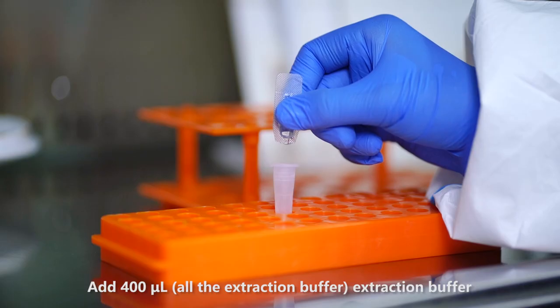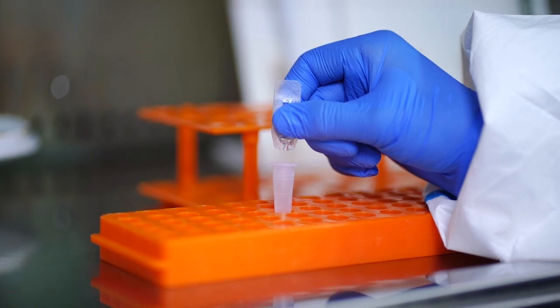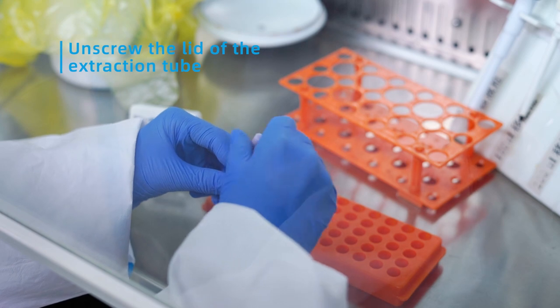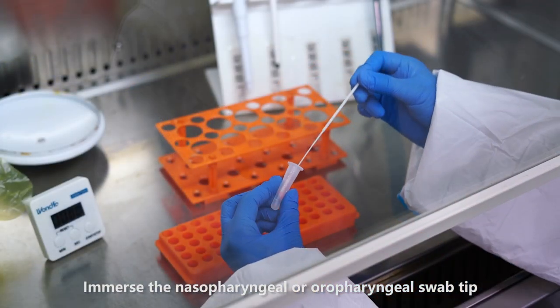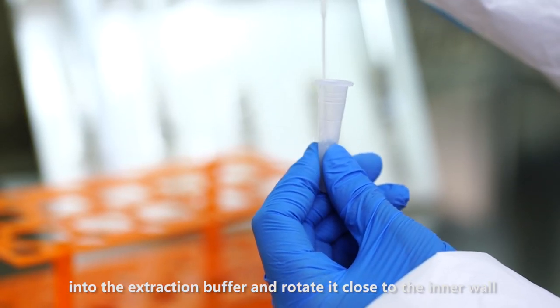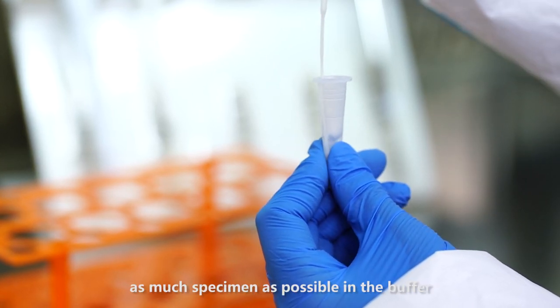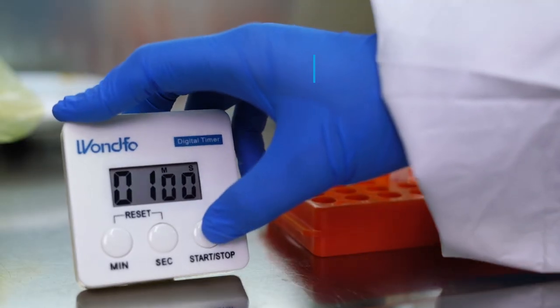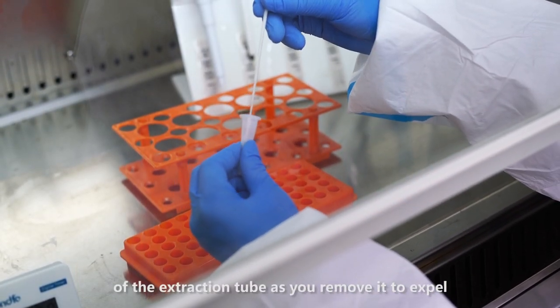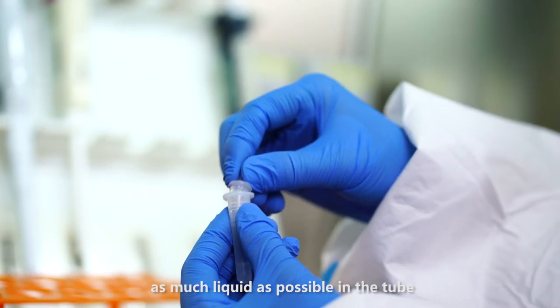Add 400 microliters of extraction buffer to the sample extraction tube vertically. Immerse the nasopharyngeal or oropharyngeal swab tip into the extraction buffer and rotate it close to the inner wall of the tube about 10 times to dissolve as much specimen as possible in the buffer. Squeeze the swab head against the inner wall of the extraction tube as you remove it to expel as much liquid as possible into the tube.